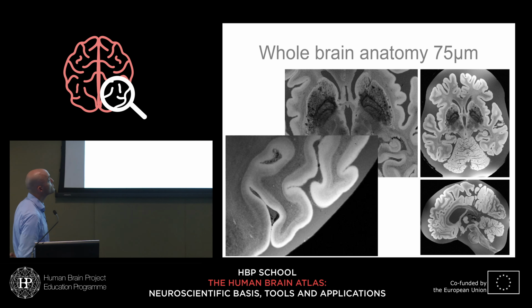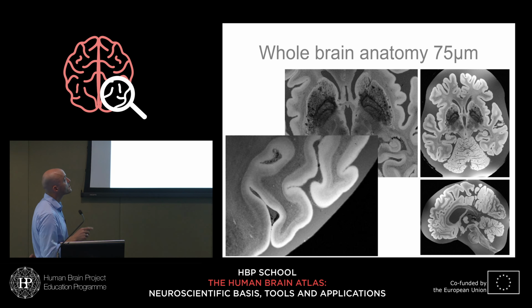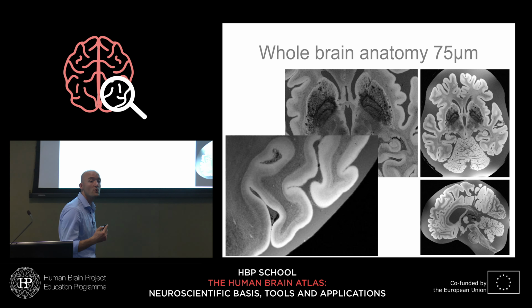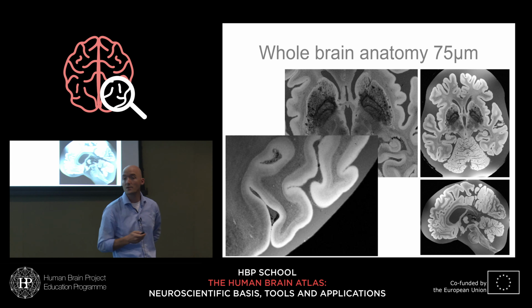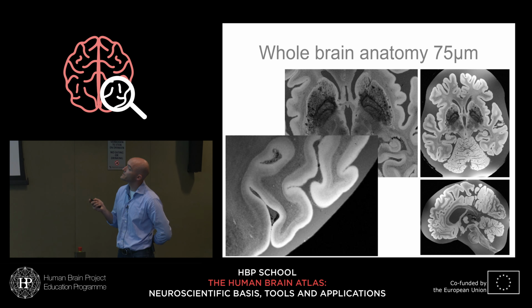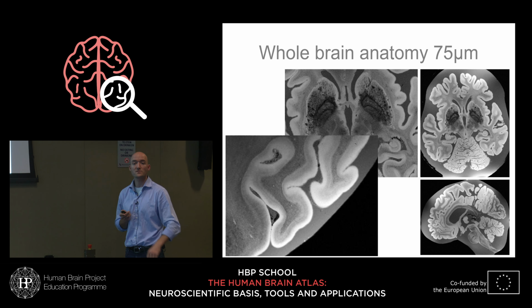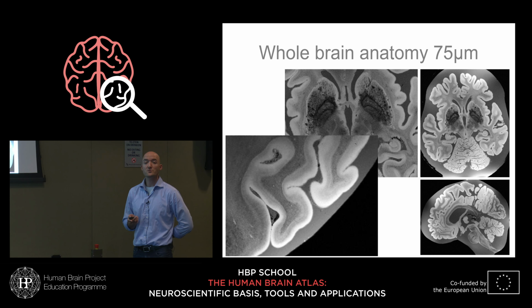And of course, if I zoom in a little bit, here in the transverse one, you see that the contrast and the contrast to noise is sufficient to see a lot of detail in the midbrain, a lot of the nuclei there, the caudate, the putamen, the thalamus. Many of those are very well defined by contrast of myelin and especially also iron content, which T2 star is very sensitive to. But most interesting to us, to our lab, is to go and look in the cortex.